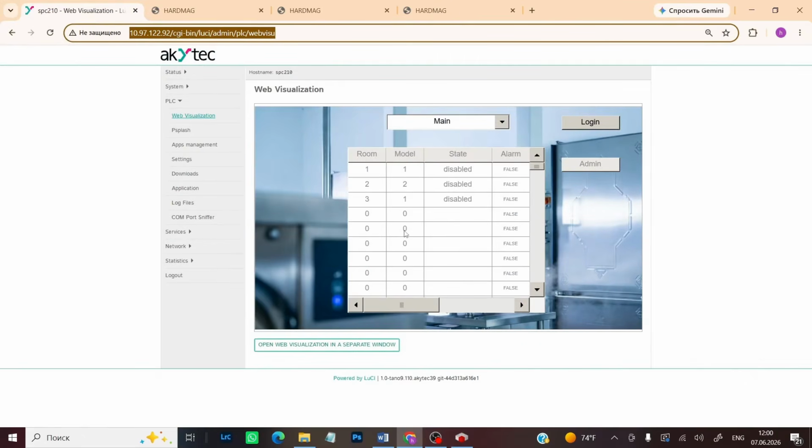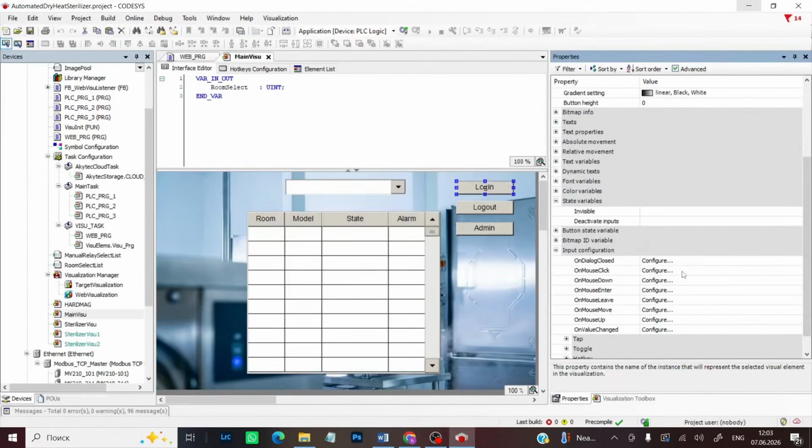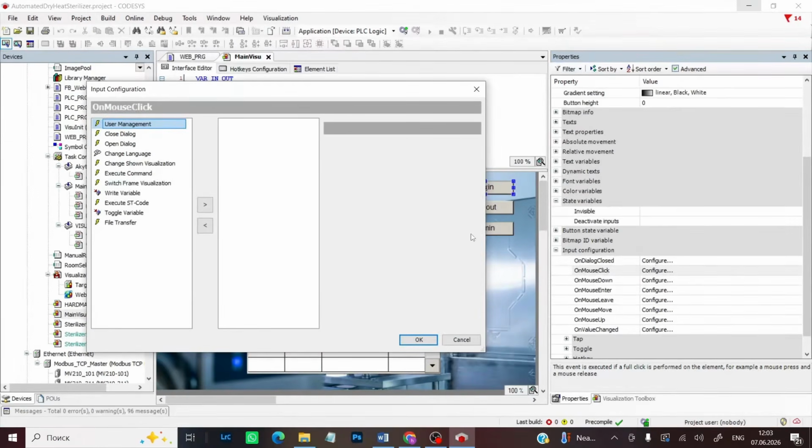In this example, I connected to our system as an unauthorized user, so I added extra buttons to the main visualization page, a user login button, and a button to manage user access rights to the control system's visualization components. Obviously, when a user is not authorized, they should only have access to the login button. When this button is pressed, the user should enter their username and password, and this functionality is quite easy to link to the button. To do this, you need to link the user management function to the mouse click event handler and select the appropriate dialog window.